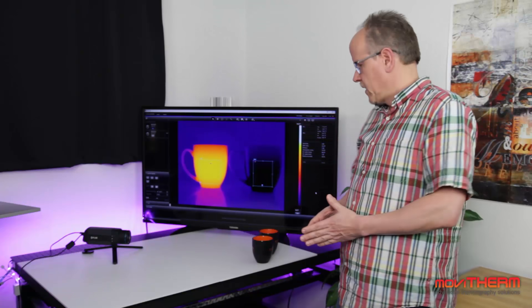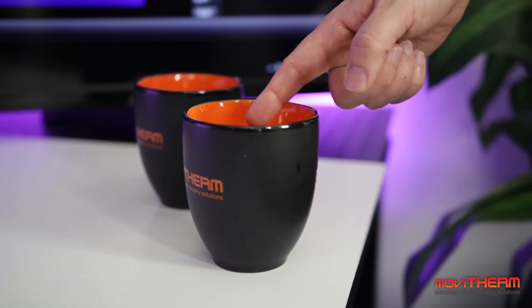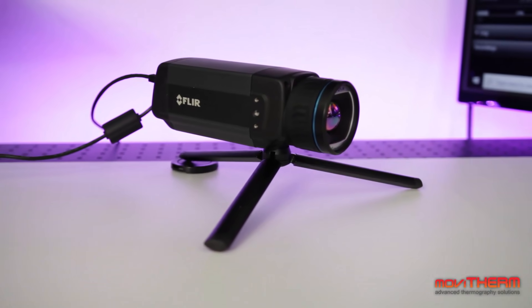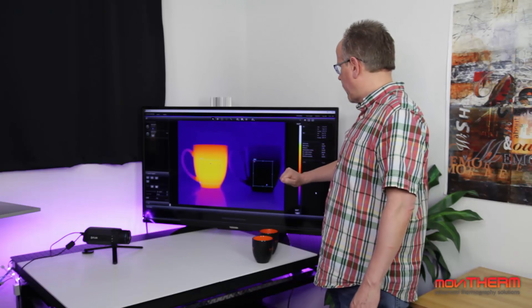So, how does a thermal camera work? To explain this better, we have set up a little experiment here. We have a couple of coffee mugs — one contains hot water, one contains cold water — and we have a FLIR thermal camera on the other side pointed at those coffee mugs. What we see here is the thermal camera image coming from the software running on a PC that we cannot see in the scene right now.